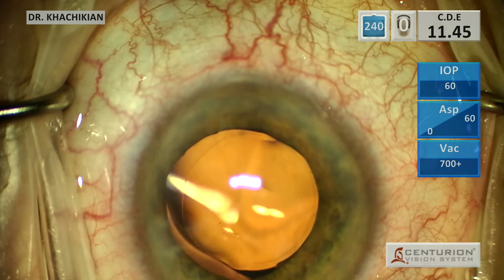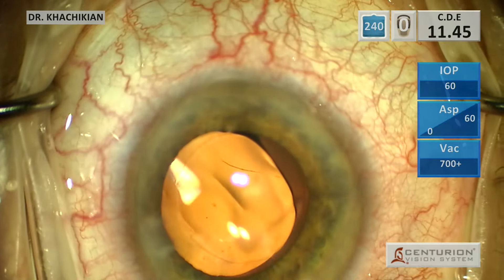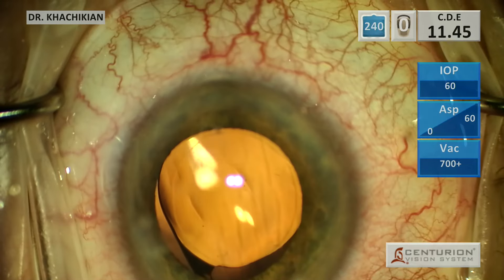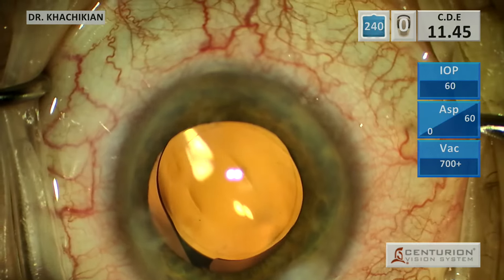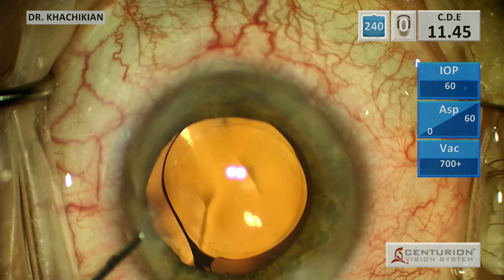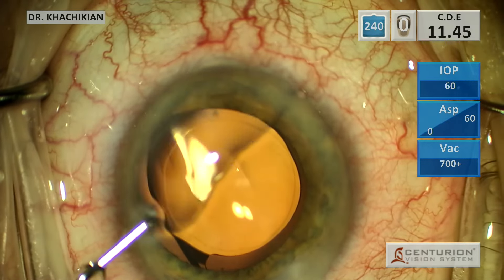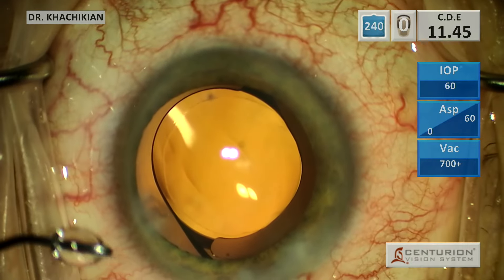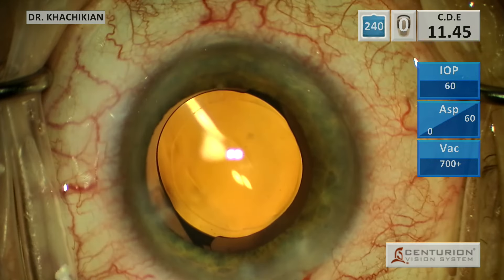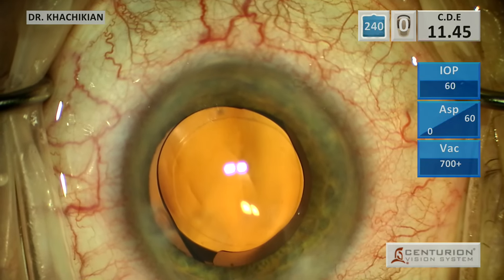And then we will seal our incisions. You can see there's good overlap of the capsular bag and the lens — it's going to be nicely centered. Really, that's what people are going to see when you're done: the incisions and capsular overlap. So we will put in a little bit of Moxifloxacin and seal up those incisions. We'll check our incisions, and that was a good case.